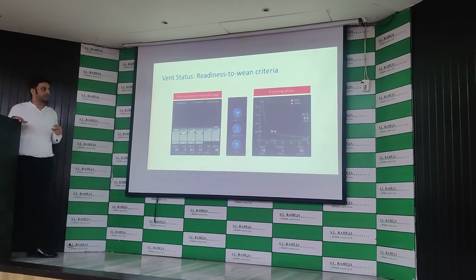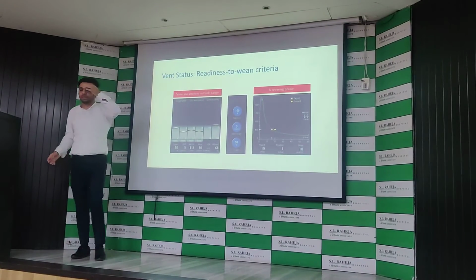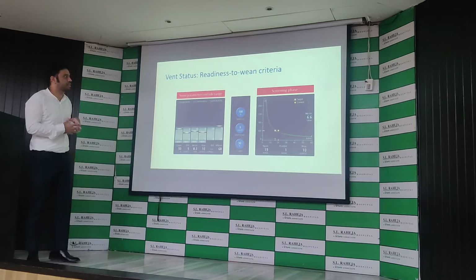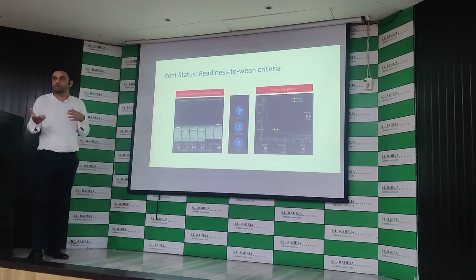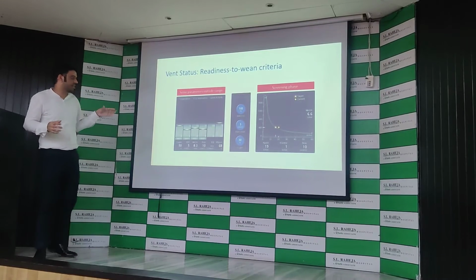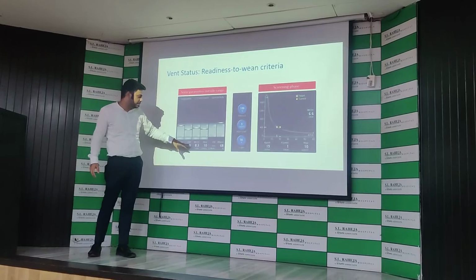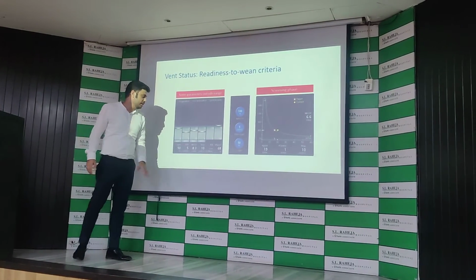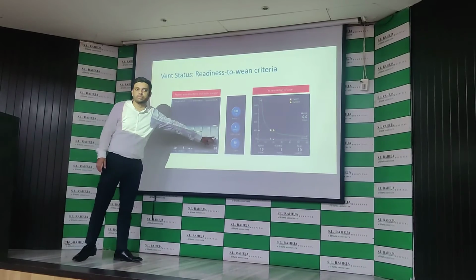So here is the weaning criteria or vent status. Vent status basically helps us analyze whether our patient is ready to wean or not. This vent status includes the patient's oxygenation status, the levels of PEEP set, the minute ventilation, the inspiratory pressure, and the percentage of spontaneous breathing.